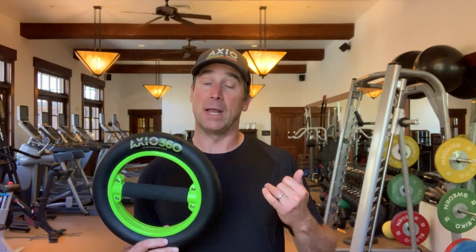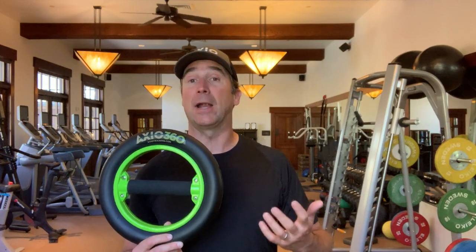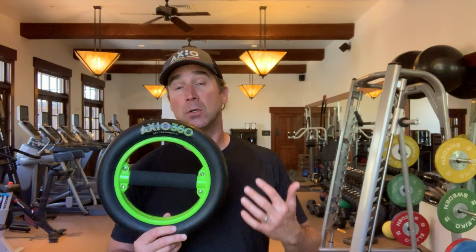I wanted something that would actually challenge dynamic stability even to a higher level than those other devices. The Axio, using rotational resistance, creates a dynamic stabilization effect around a 360-degree axis. It's also much more difficult to sense and control, so the sensory-motor component is far more challenging. You'll find that people have a challenging time trying to figure it out because their nervous system takes a little while to get it.